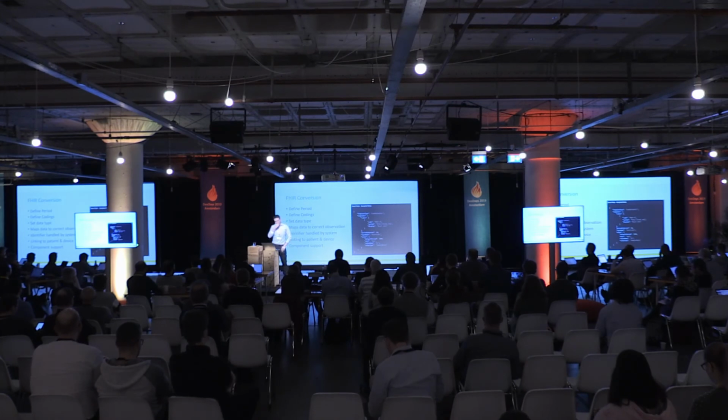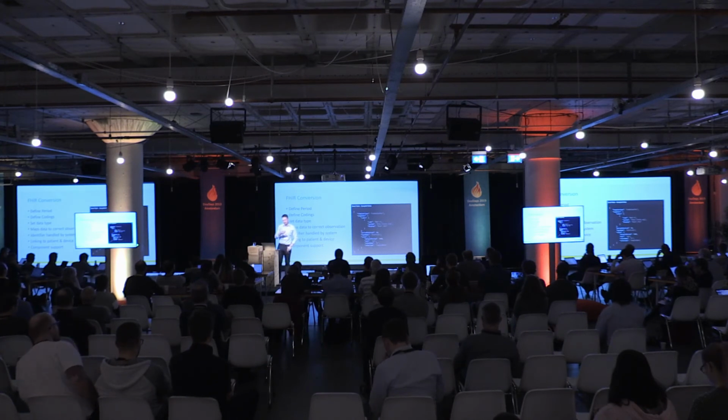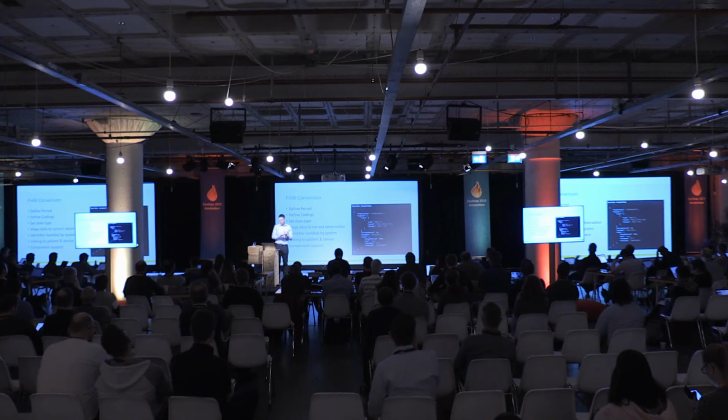Next phase is the FHIR conversion. So there's a couple different things going on here. There's some things that you define, and then there's other things that the system implicitly does for you. Some of the things that you would define is the period of the observation. So do you want to create a 1 hour observation, a 1 day observation, or a single instance?